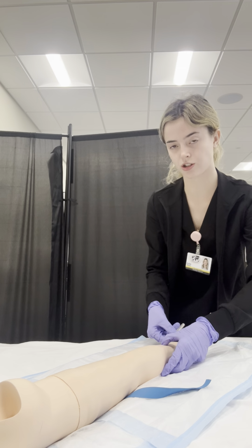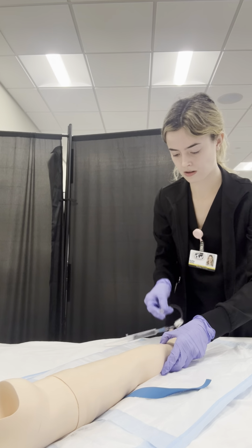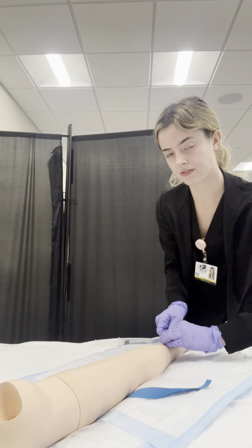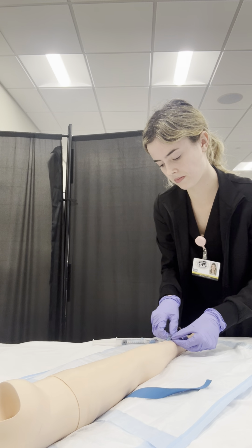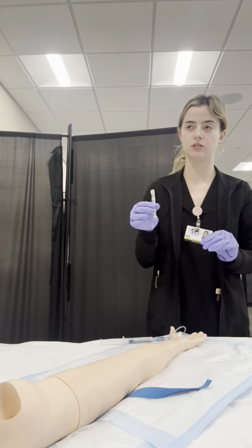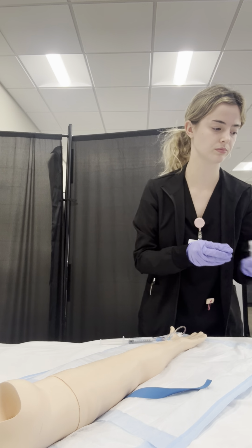and then I am going to remove this. And I activated the safety on the needle. I'm avoiding touching the insertion site. I have my needle, and I would put that in the sharps container.